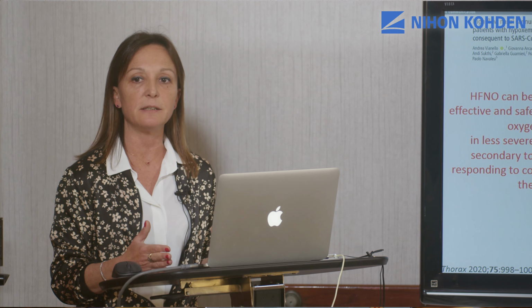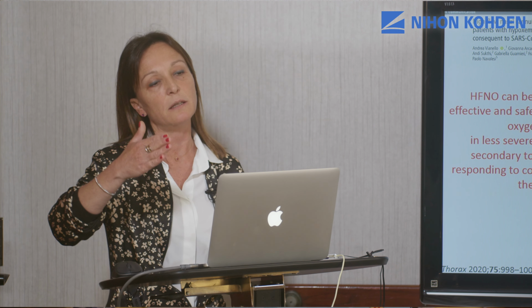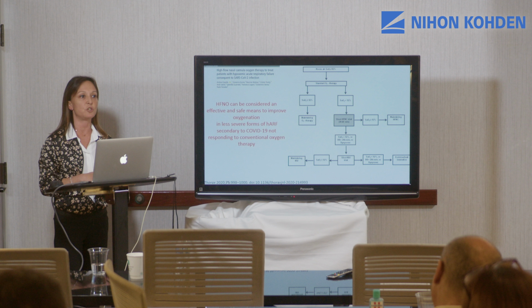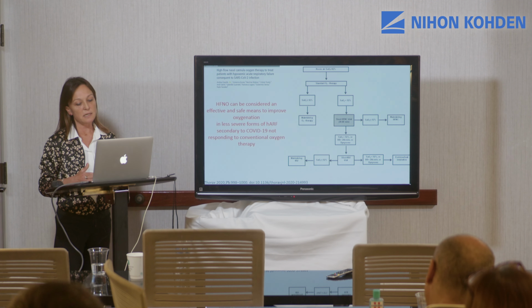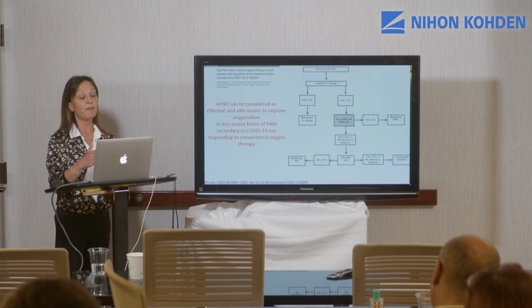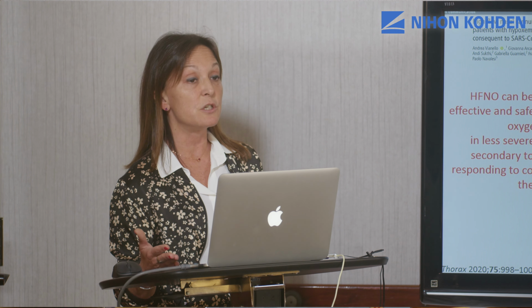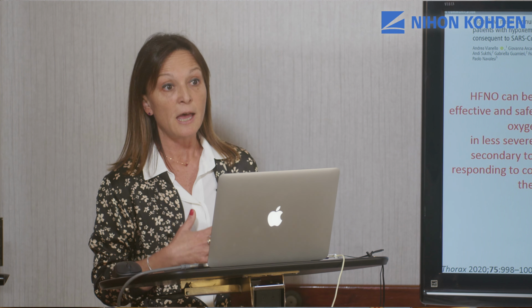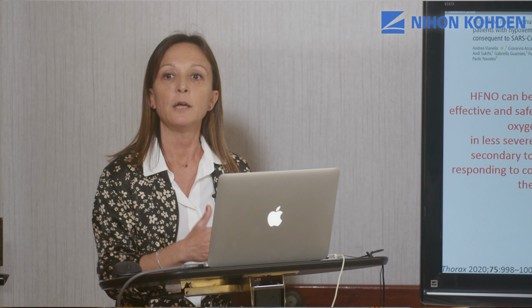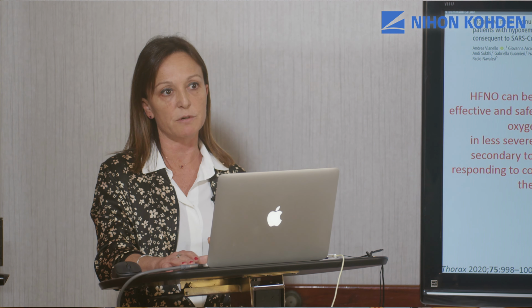And you have to find a value that is your borderline, and you can see that if the patient is able to maintain the saturation above 90 or 92%, it can keep standard oxygen therapy. In any other case, after the traditional oxygen therapy, you can switch to high flow nasal cannula. If high flow nasal cannula is not enough in reducing work of breathing and in improving oxygenation, then you can switch to NIV. And again, if NIV is not enough for that patient, you have to be ready to promptly intubate that patient, in particular if we are speaking about acute hypoxemic respiratory failure.